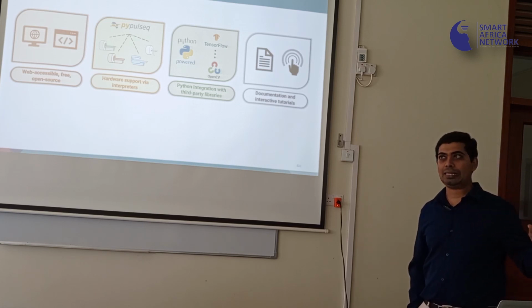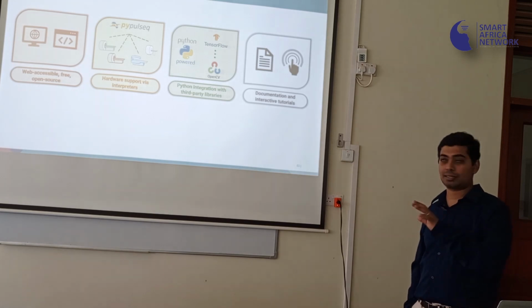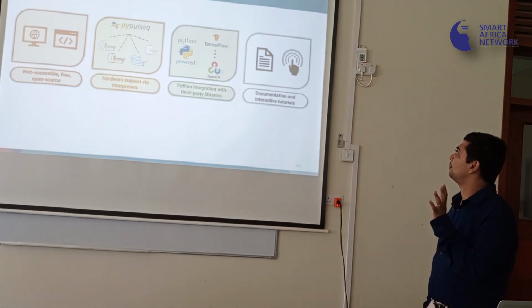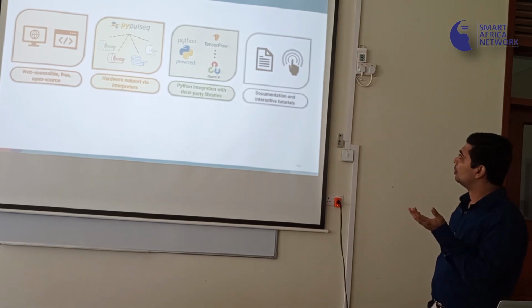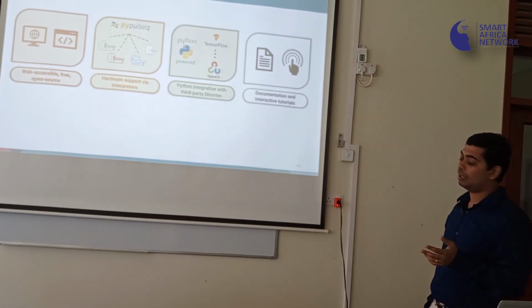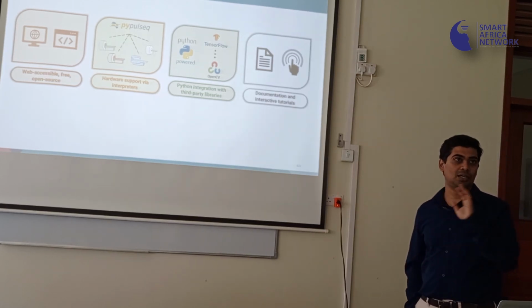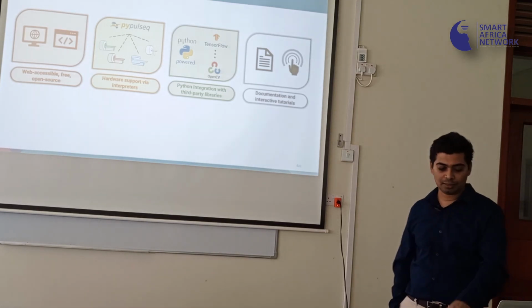You have at least 3 open source hardware platforms that this can support. Then you can integrate this with other third-party Python libraries. We've shown a couple of examples. You will find exhaustive documentation of all of these tools on our GitHub webpage.